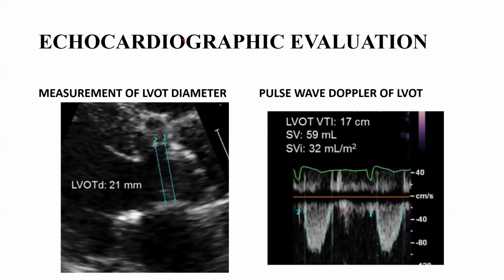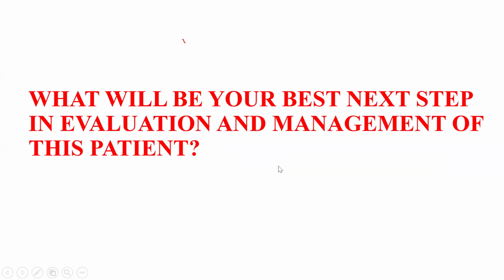Okay. So likely when you have high left atrial pressures, or there's severe concentric LVH, that can also give you a paradoxical low flow, low gradient. It's clear. Thank you so much.